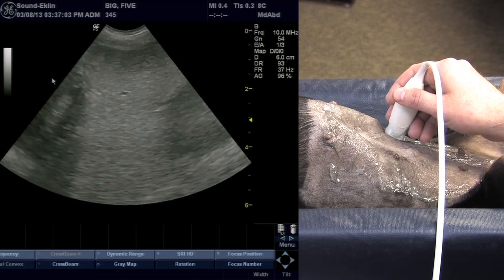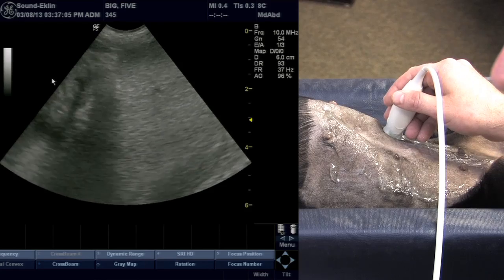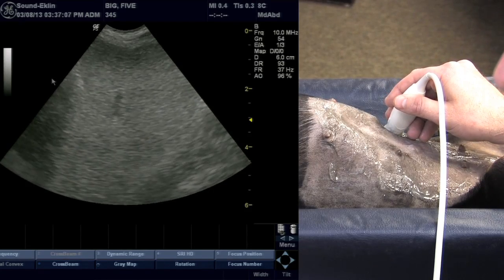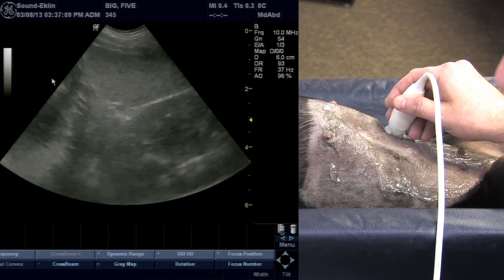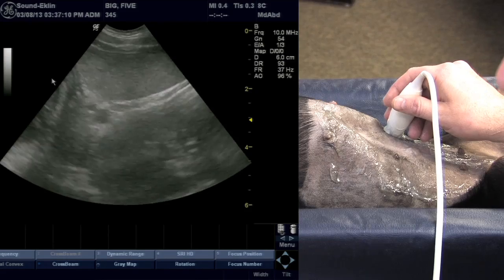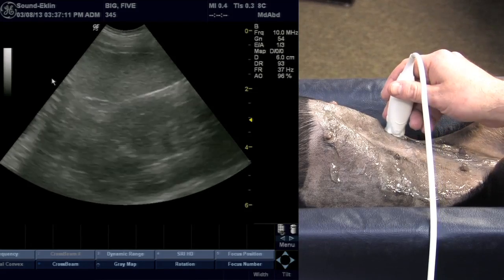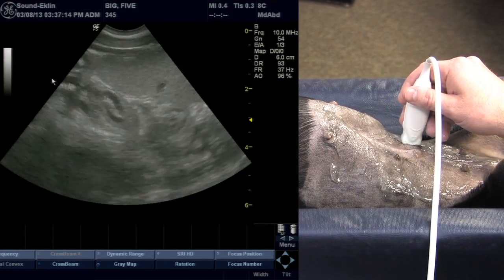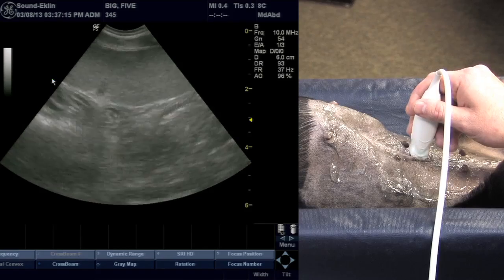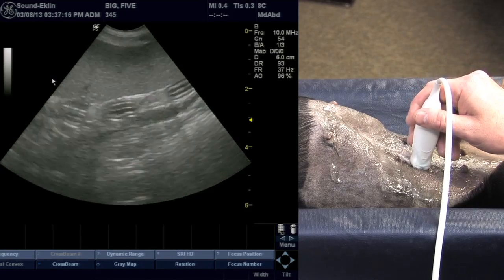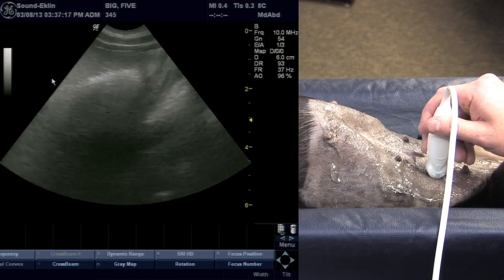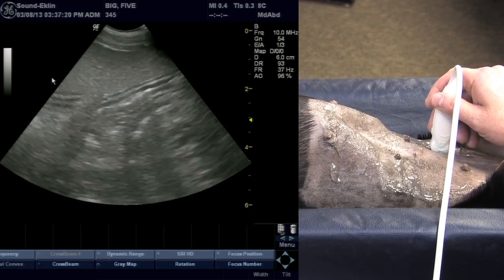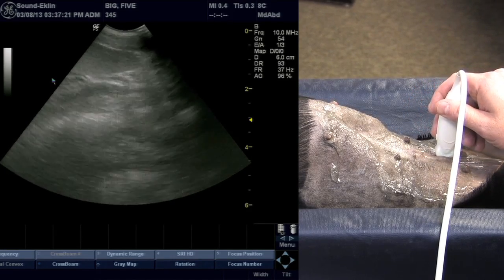We've got kidney and stomach. At this point I just fan towards the left body wall — it doesn't take a lot of motion — and we'll see the head of the spleen. We straighten the probe perpendicular and slide back and forth again in that typewriter fashion so that we evaluate as much of the splenic parenchyma as possible.